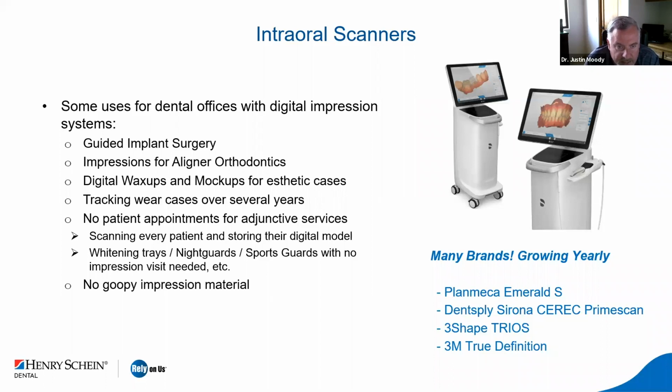Today, I can store this in the cloud and not take up any space in the basement. I don't have to run downstairs and look through them and try to find something, whether they end up needing a temporary or something like that. Or we can watch the wear of these, as we'll talk about as well.